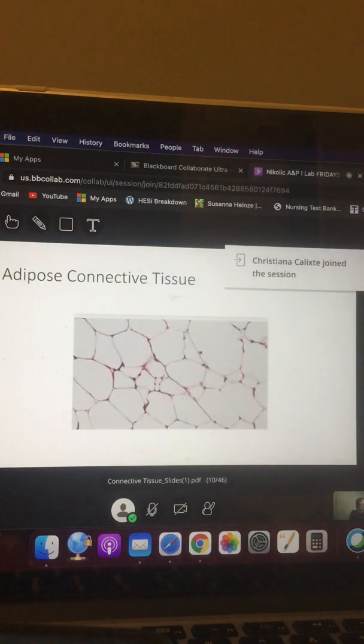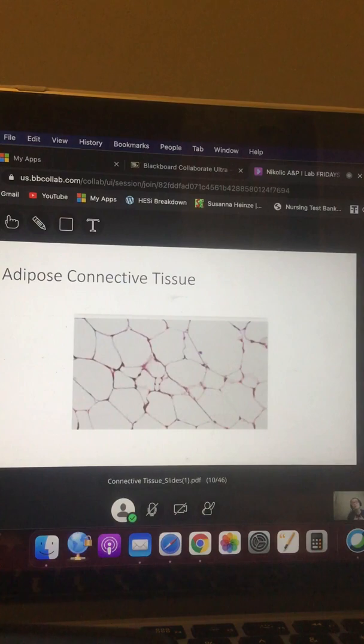It is adipose connective tissue. Okay? Awesome. Unfortunately, I don't choose the image, but they do have good images. I will tell you they do. And like I said, I'm going to check it over to make sure it's not janky. If something's janky, I'll be like, hey, can you use this image? Yeah, exactly. We want it easy to identify. Like, we don't want them to choose something that reflects their vision right now. That's not what we're going for.